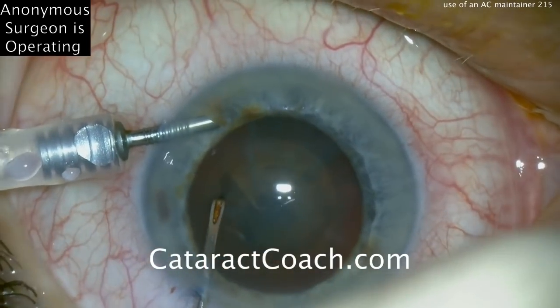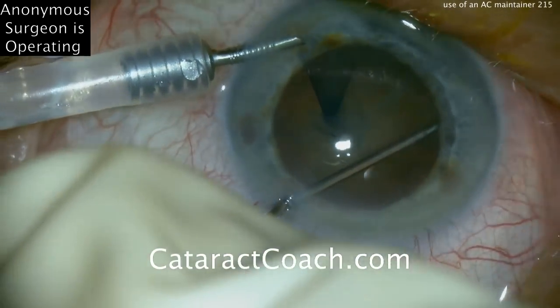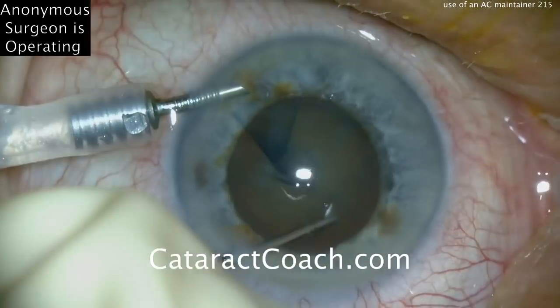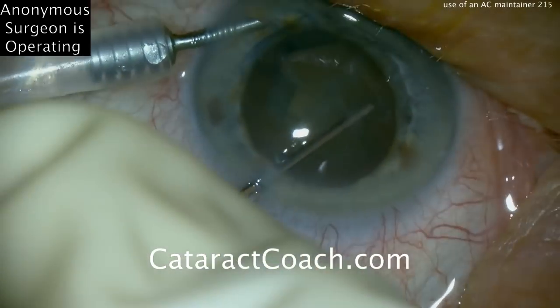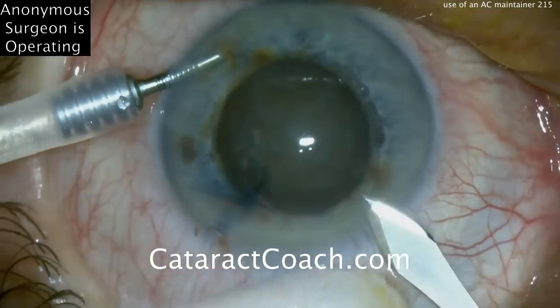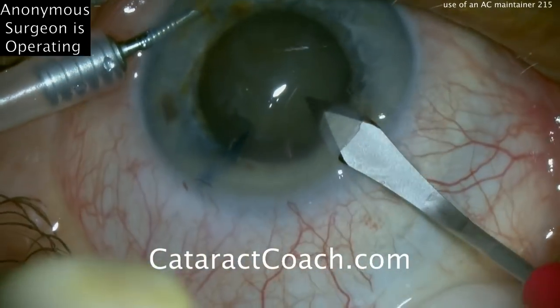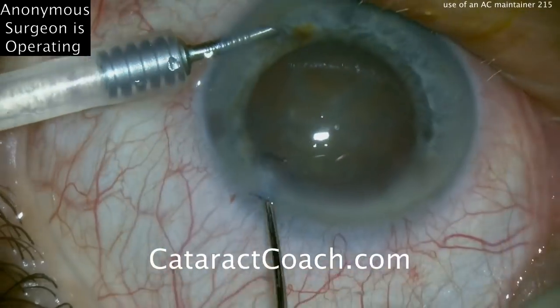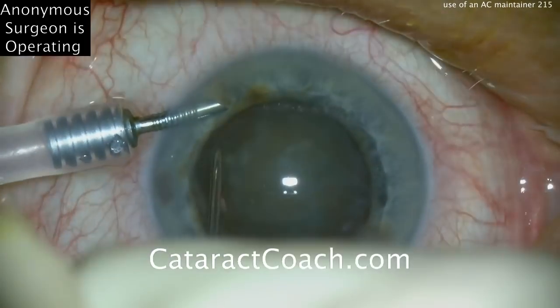The capsulorrhexis is being made with just a cystitome through a paracentesis. Now a little hydrodissection of the lens nucleus. The anterior chamber maintainer keeps the anterior chamber maintained — it's an infusion line, so it creates an inflow pressure. There's the main incision being created, going inside the eye. That incision is a little bit too much in the clear cornea; it's not nicking the limbal vessels, which is something we like to do.